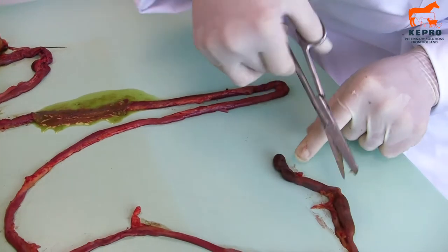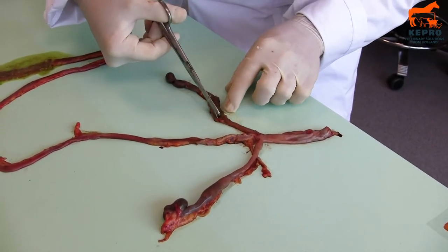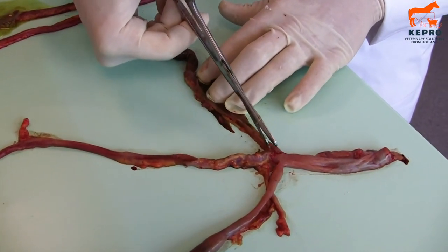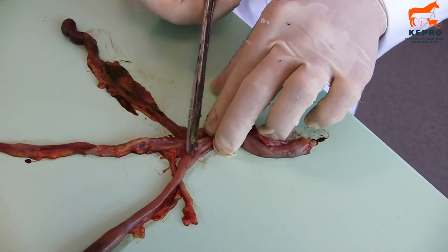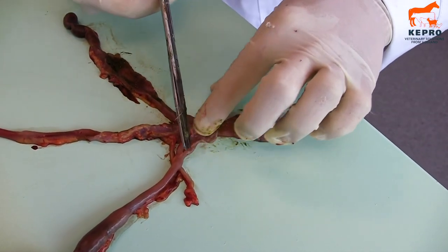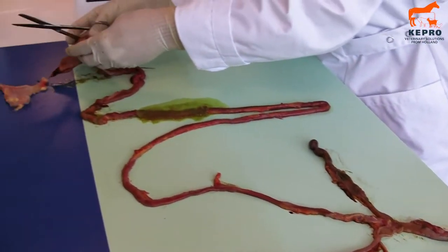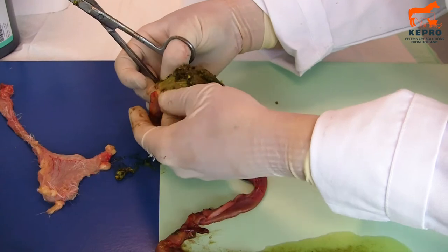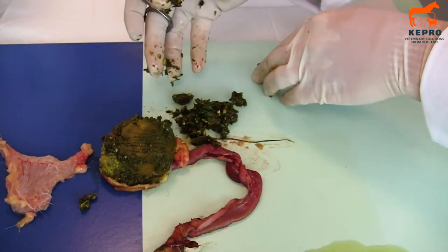Then if we look into the cecum, which is a very important place for coccidiosis — this looks perfect. And then very important is also to look here, because here you always have the lymph nodes of the gut. So if you have a viral infection of the gut, you have the lymph nodes here. And those are not enlarged. So the gut health of these chickens was quite good. Then we also need to open the stomach. You can already see it is quite old. The lining is perfect. So the gut health of these chickens was very good.